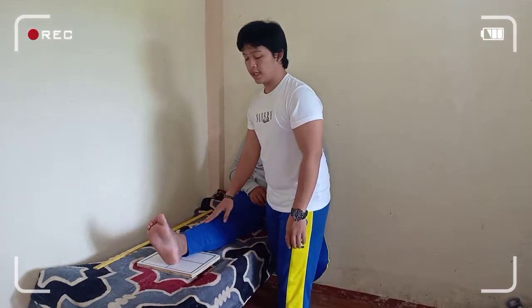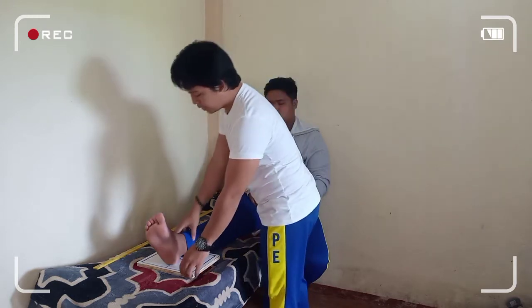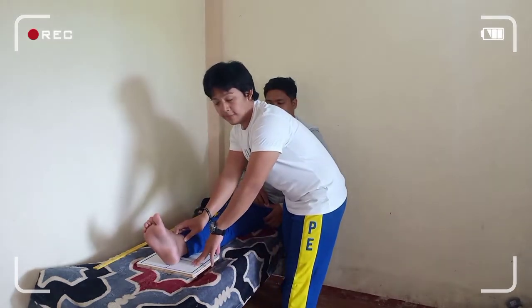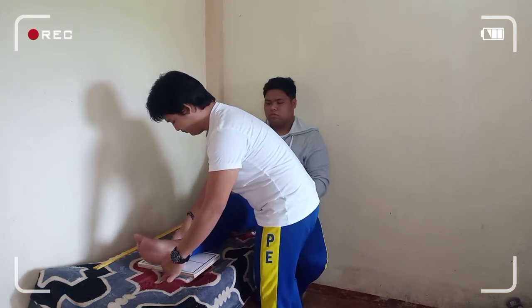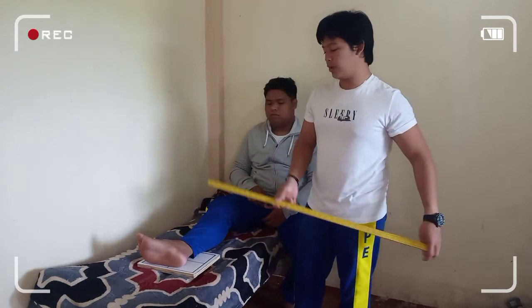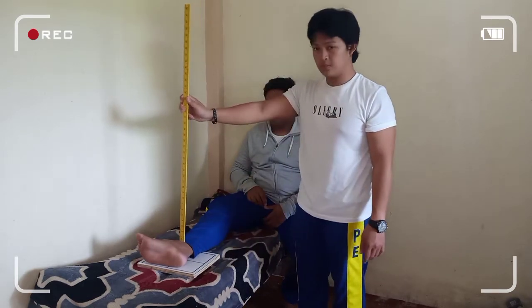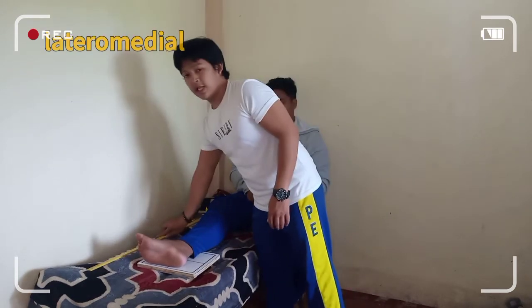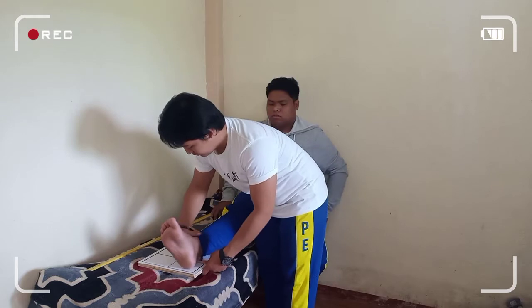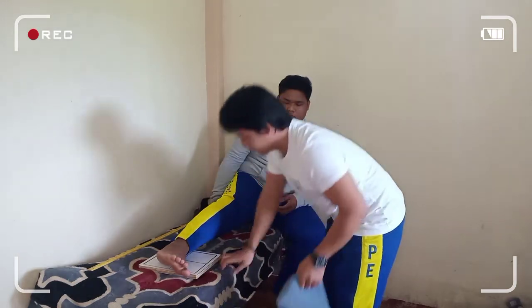Place the ankle in anatomic position with the foot facing upward, and rotate the foot to the affected side. The central ray must be perpendicularly directed to the medial malleolus. For the lateromedial, rotate the foot on the unaffected side. We can use a sandbag for the knee of the patient for support.